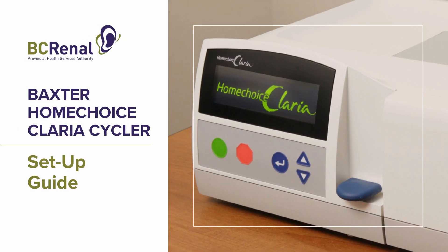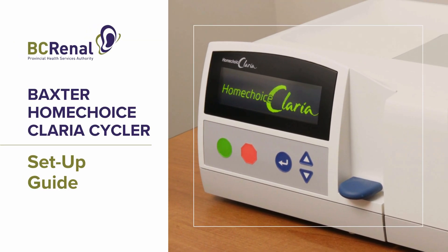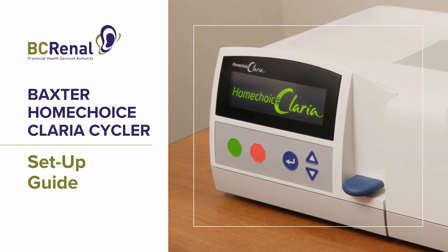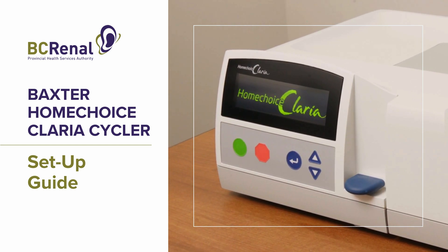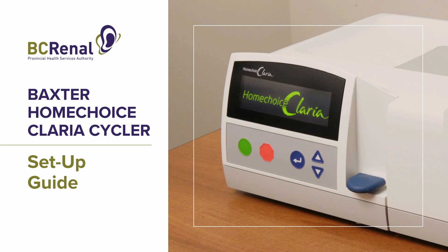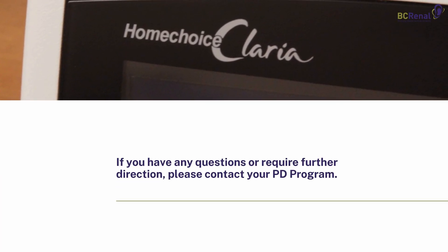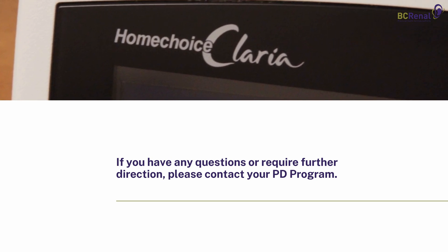The following video demonstrates the steps involved with setting up the Baxter Home Choice Claria Cycler. The content of this video is meant to supplement training provided by PD programs in BC for patients using the Claria Cycler. If you have any questions or require further direction, please contact your PD program.